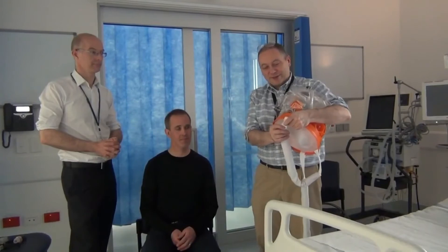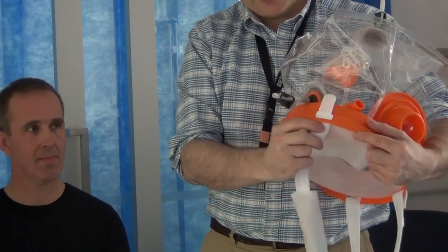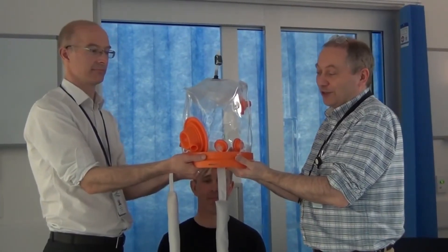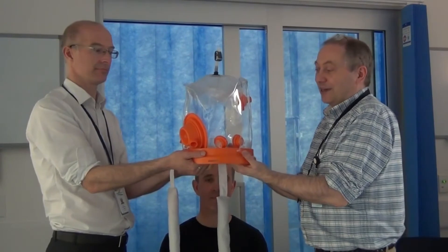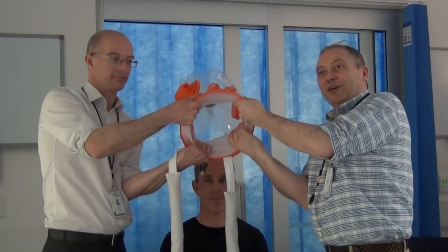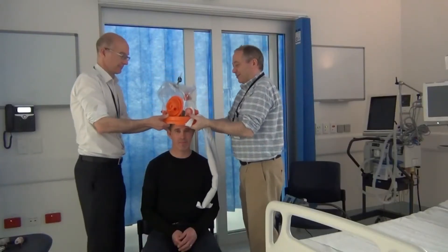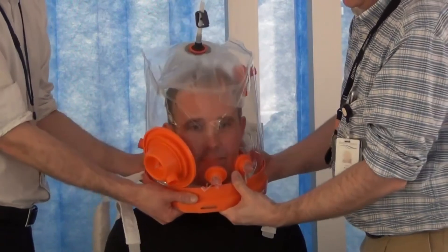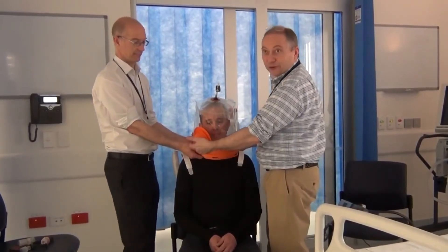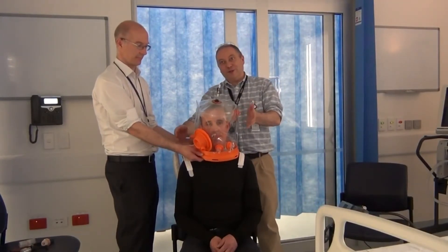Prior to fitting the helmet you should release each velcro strap and detach one end of it from the base frame. In order to place the helmet onto a patient you require ideally two clinicians. The clinicians put their thumbs on the outside of the frame and their fingers on the inside of the neck ring and pull the neck ring open to make a large aperture. We will gently now lower the helmet onto the patient and release the neck seal. Currently the patient is breathing both through the free breathe valve and through both of the gas ports which are currently open to the environment.